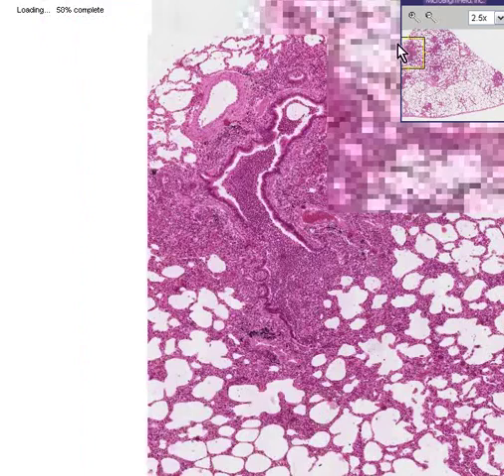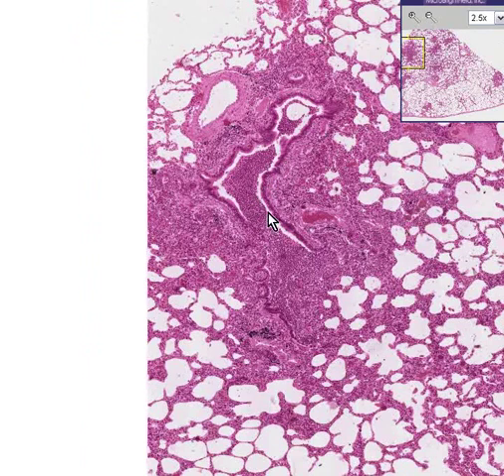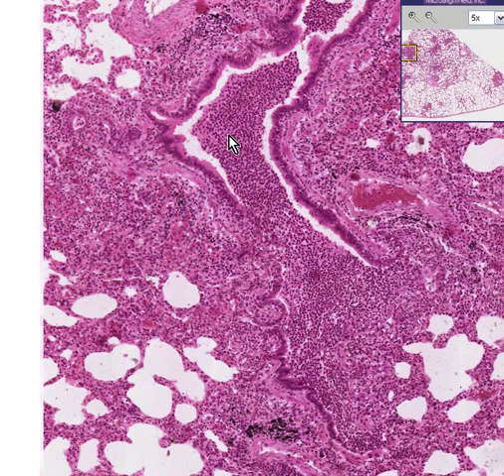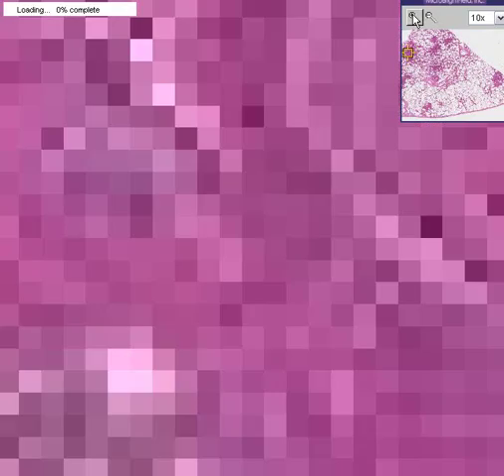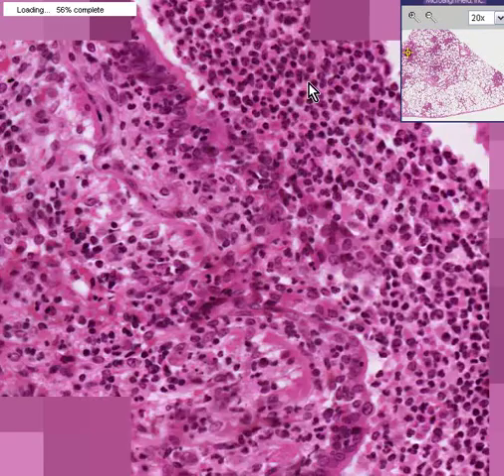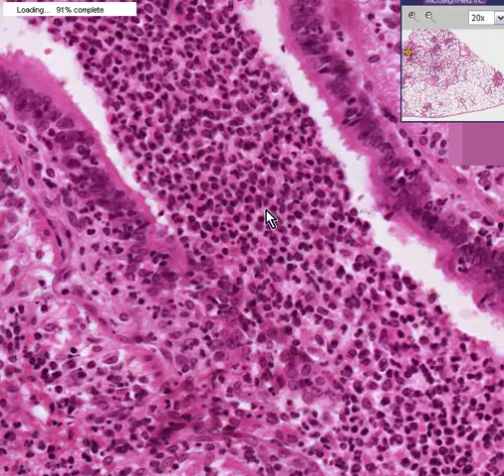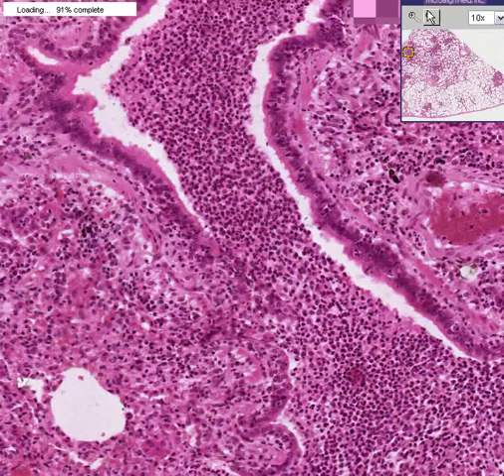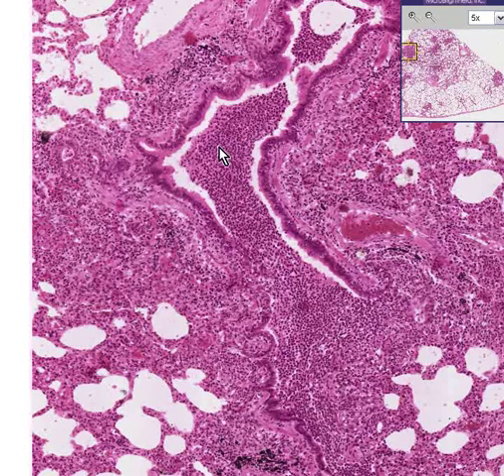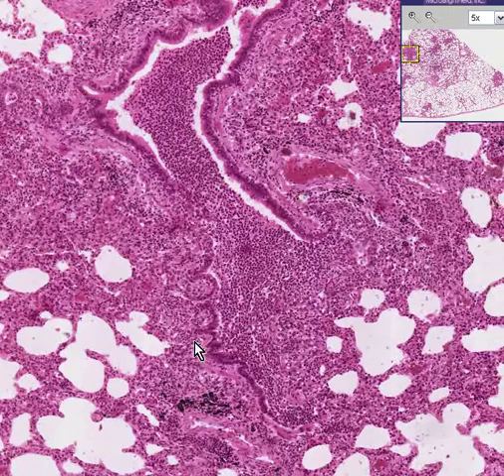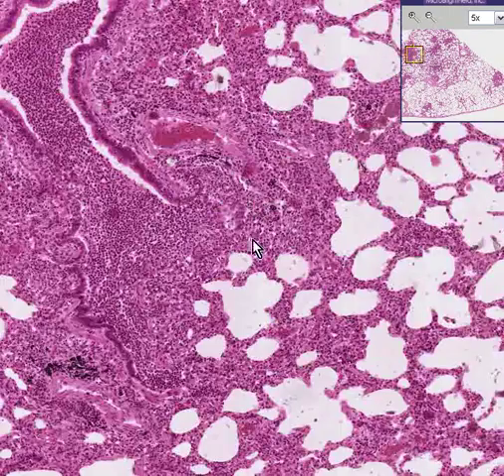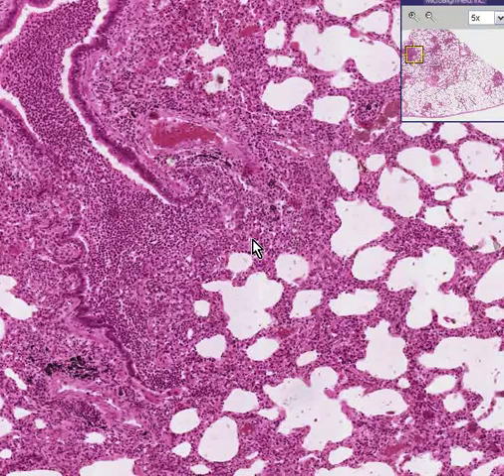Here's another area. You can see a bronchus lined by columnar epithelium. You can see that it's loaded with pus. And you can see there are neutrophils. Then you can see that this pus, an inflammatory process within the bronchus, has spread to the alveolar spaces here. This is a very, very nice case of acute bronchopneumonia.